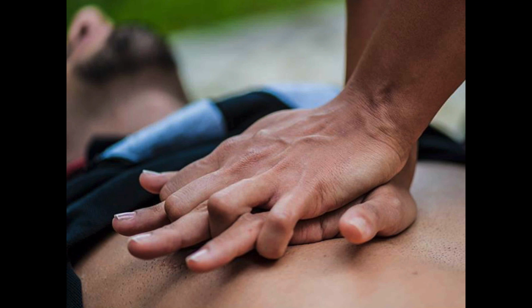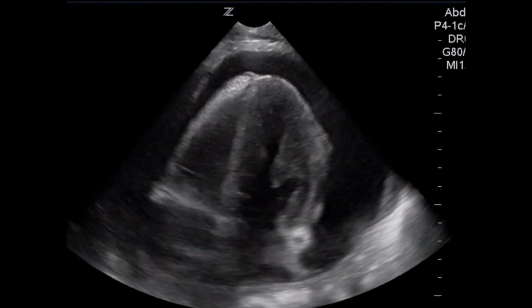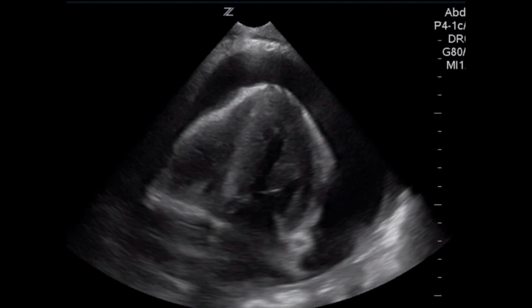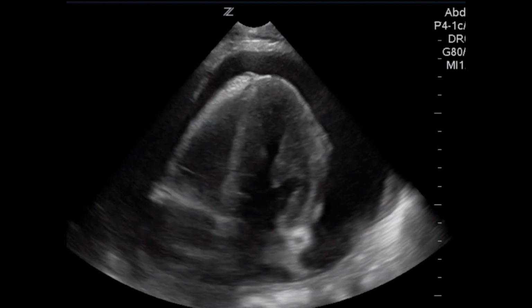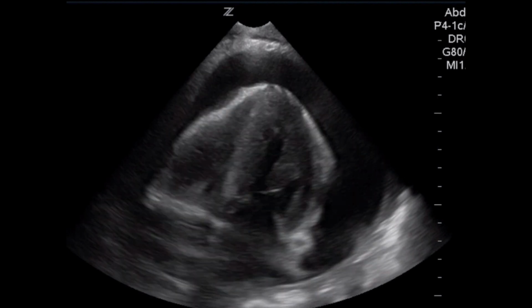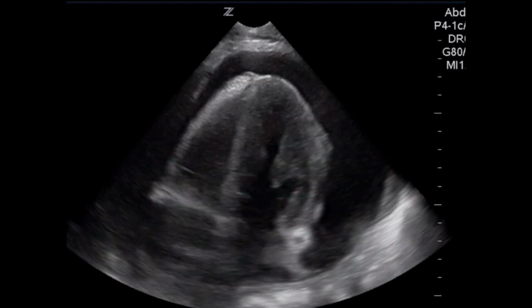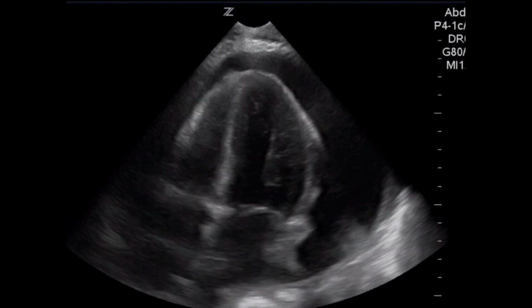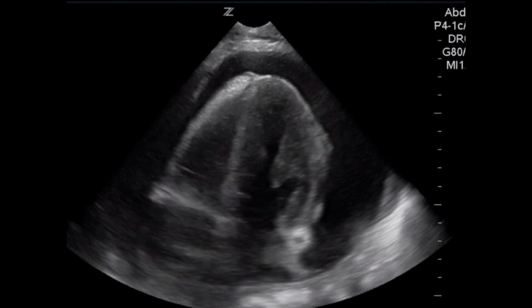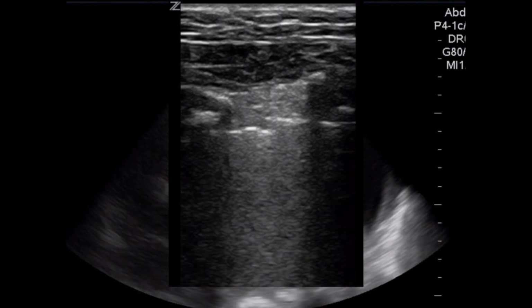When we think about how we use ultrasound typically in these CPR patients, we think about reversible causes. The patients may be in PEA arrest, severe hypotension, and we really all want to find the giant pericardial effusion and tamponade so we can stick a needle in it, fix the patient, and we come out looking like a hero. But this just doesn't happen that often. And it is worth looking. I'm not saying it's not worth looking, but it just doesn't happen that often.